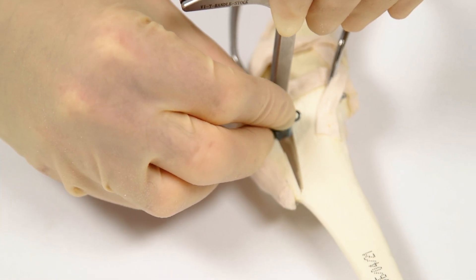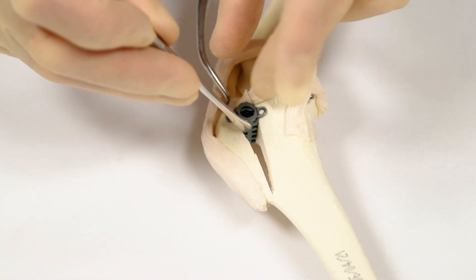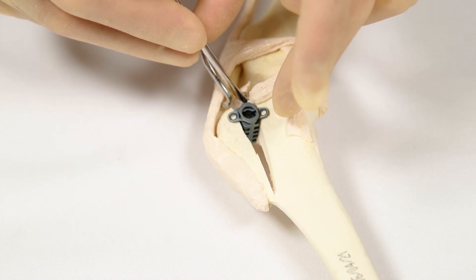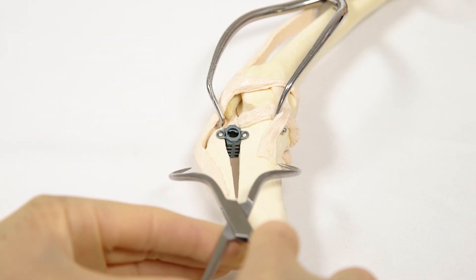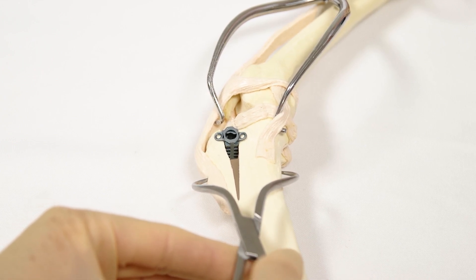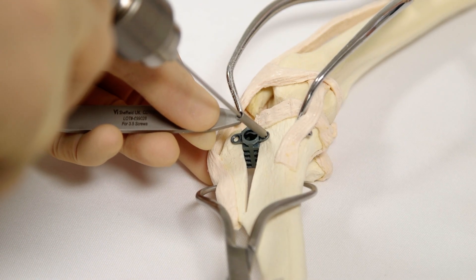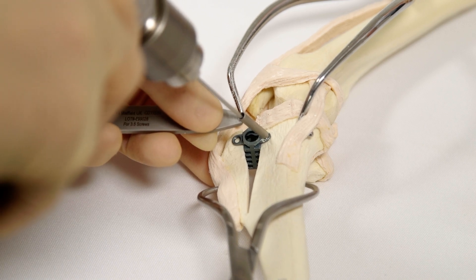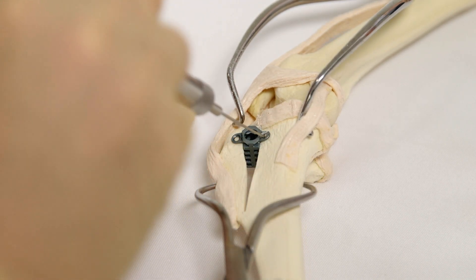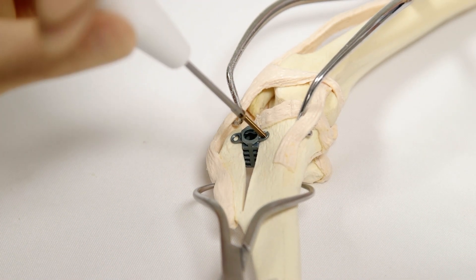Position the cage in the osteotomy with the wide aspect proximal and the narrow aspect distal, approximately 3 mm distal to the most proximal aspect of the caudal cut surface. With the cage positioned correctly, compress the advanced tibial tuberosity using a large pair of single point reduction forceps placed cranial to caudal. Drill the pilot hole for the caudal cage screw using a 1.8 mm drill bit and drill guide, aiming caudal and distal. Measure the depth of the pilot hole and place a 2.4 mm titanium screw of the appropriate length.